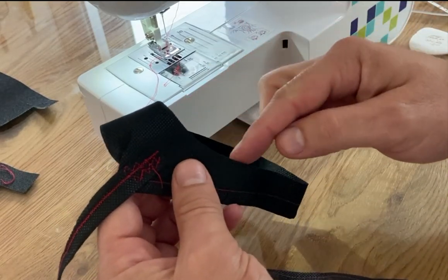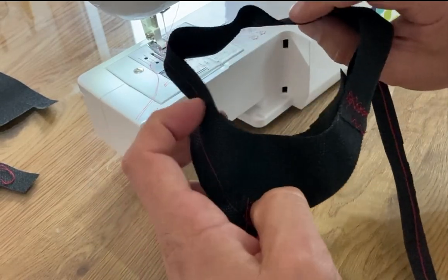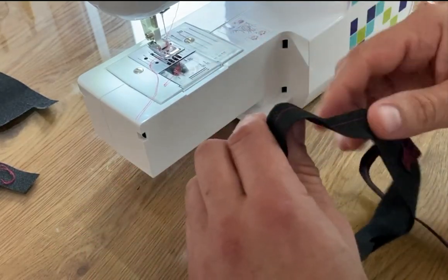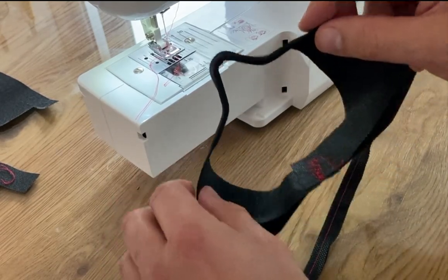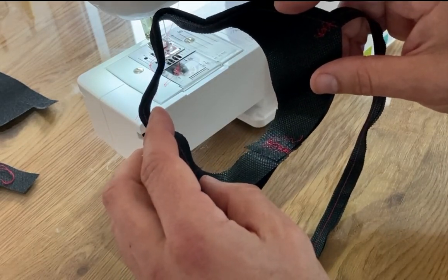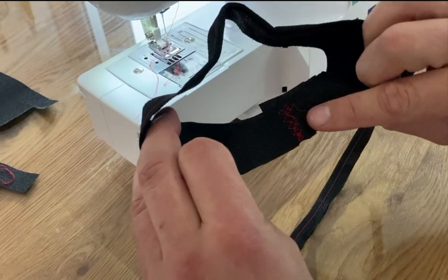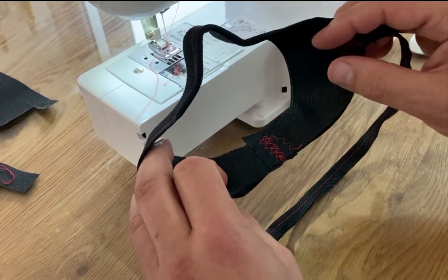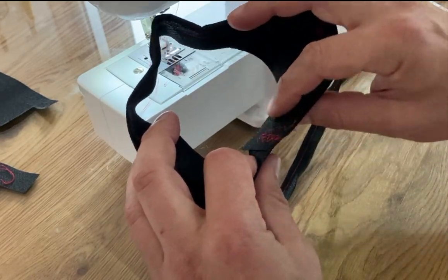Another sew that we could do to finish this is zigzag all the way around these edges on the, not so importantly, the inside, but more importantly, the outside where it may inadvertently touch your face. Either way, structure of the nose wire holds that across your cheeks, tightens the surgical mask. These wider flanges here are because the surgical mask is rectangular and this one isn't rectangular. This piece under the chin is maybe okay for me, I don't know. I put it on and then go, darn it, I've made it too loose, and strategize to maybe tighten that, reduce that gap across there for my face.